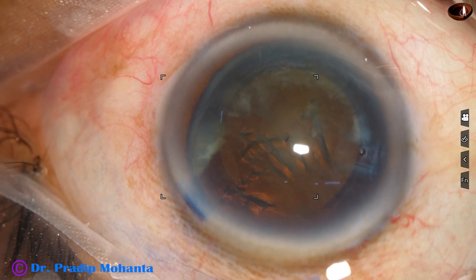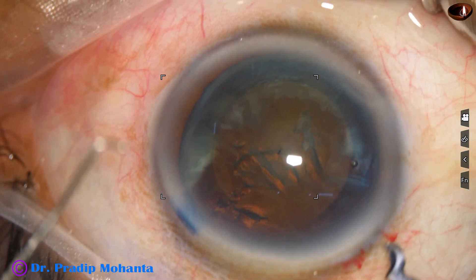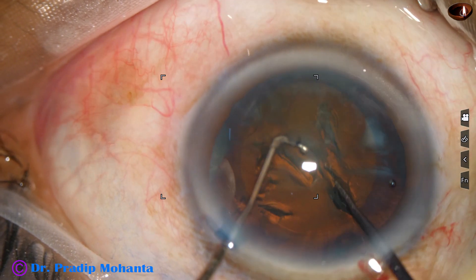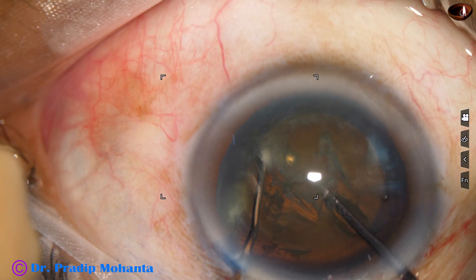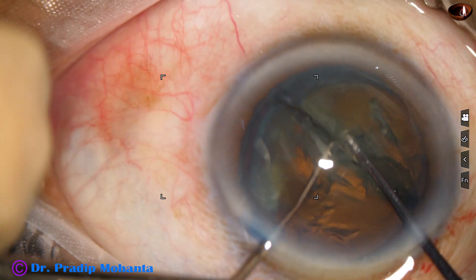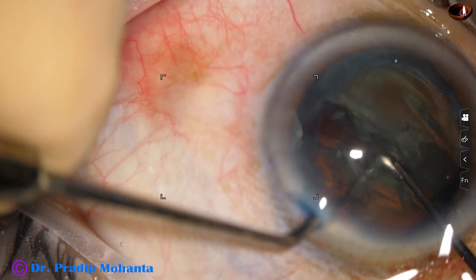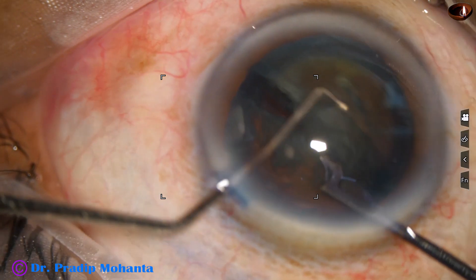After filling up the anterior chamber with visco, the pre-chopper is in the right hand — the dominant hand — and the sustainer is in the left hand. Just in front of the main incision, the pre-chopper goes into the softer part of the nucleus. The sustainer hooks the opposite equator. The two instruments come toward each other and the nucleus is divided into two hemi-nuclei. In this case, because of the stickiness of the lens fibers, the nucleus is resisting division.